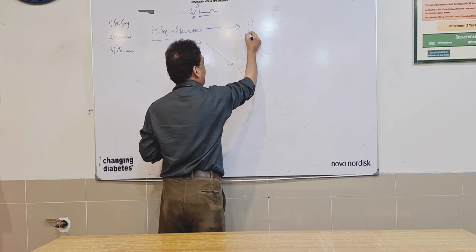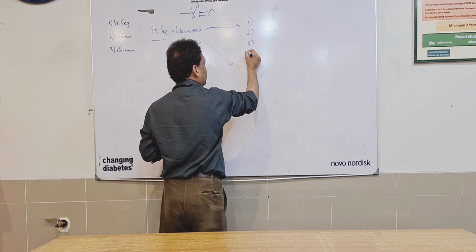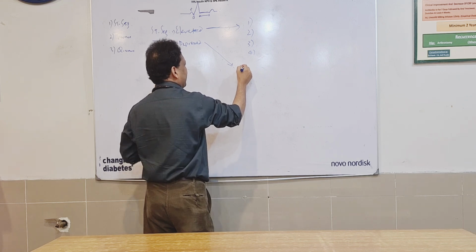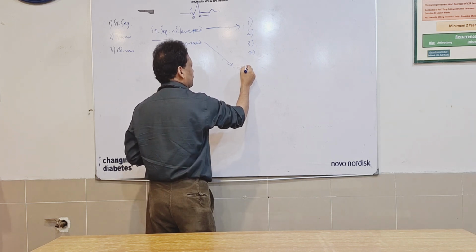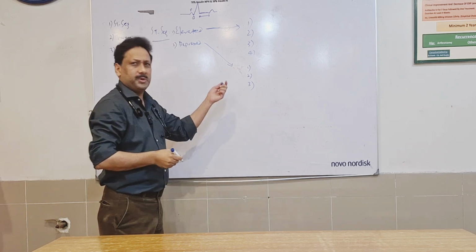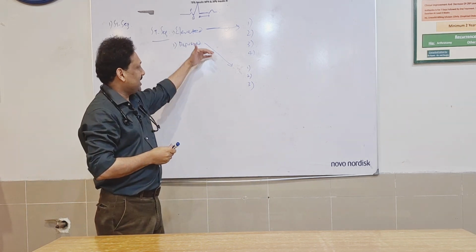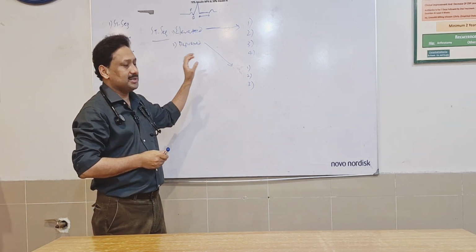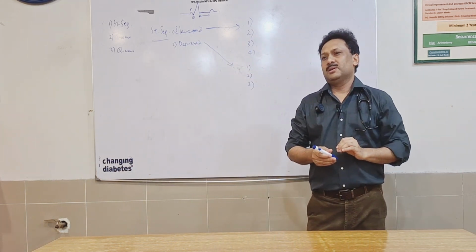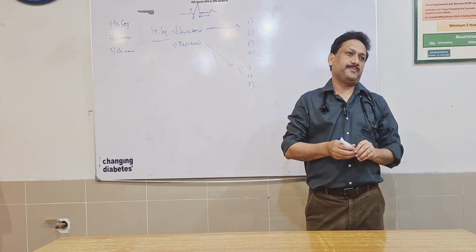Elevation has four important differentials which you must know. ST segment depression also has 2 to 3 important differentials which you should know. 2 to 3 differentials are enough as far as depression is concerned. So what are these differentials? And when will we consider the elevation important?